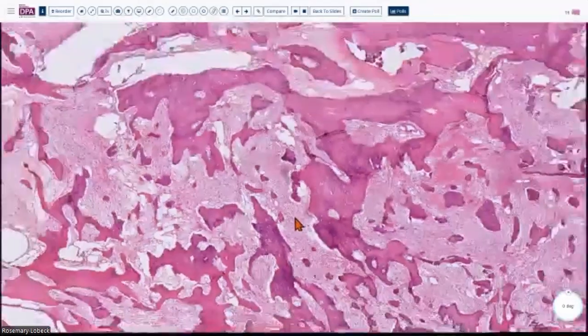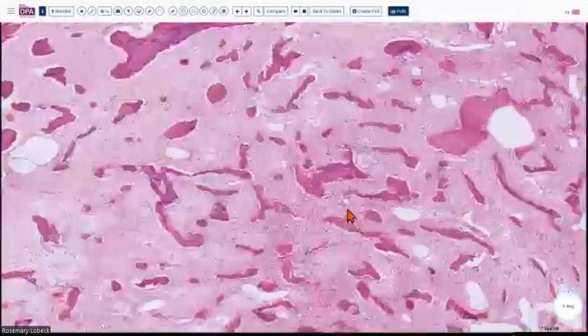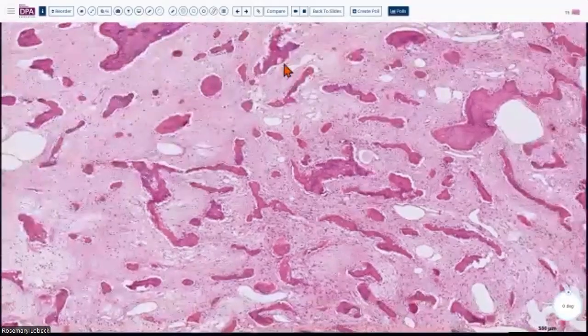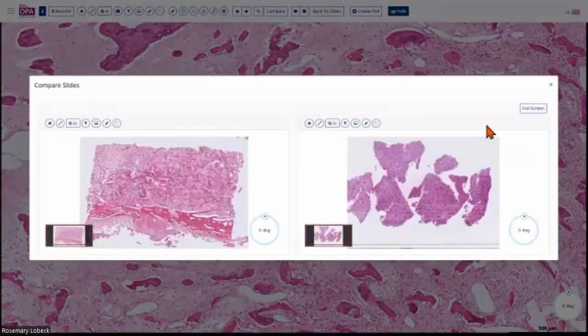in this case, right? Another feature that I want to show is if you go to the area that looks like this, for example, right? So I focus in here and I show you this, and if I ask you, what do you think this most probably is going to represent? Most of you are going to say fibrous dysplasia, right? And you would be absolutely correct, just not in this case, right? So I just wanted to compare a case of fibrous dysplasia with this one. Let's see how this works out.